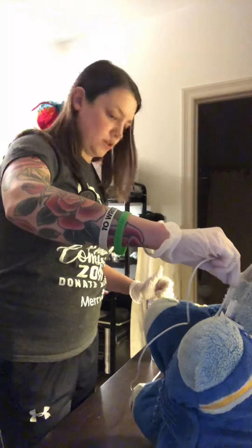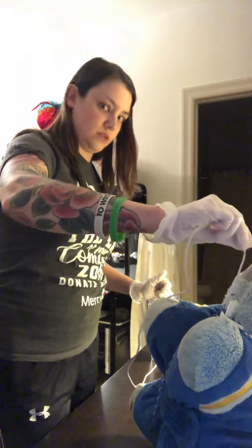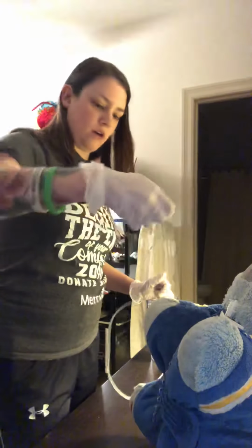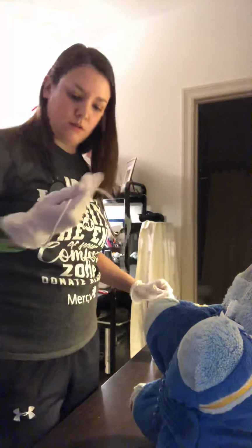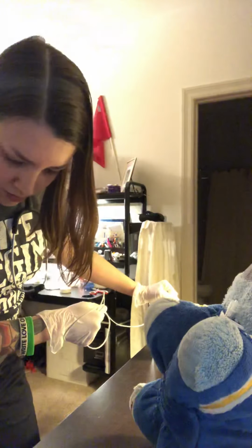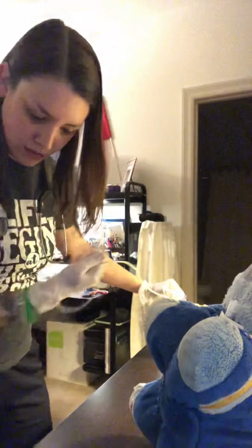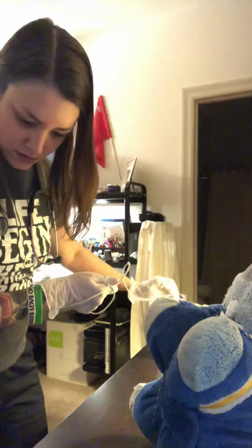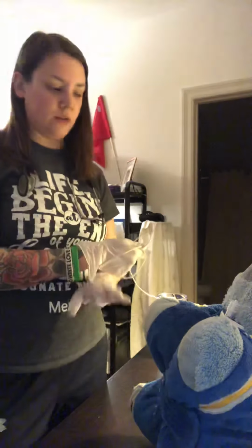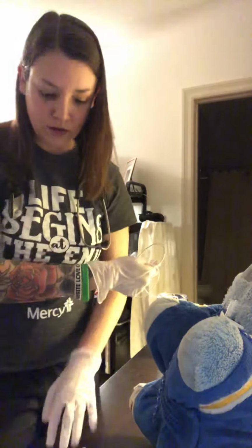Then I would apply suction and pull it out, kind of circle it around in there a little bit, and take it out. The patient might cough, so I'll go ahead and recoil this back around. And then I do sterile saline again, kind of get it all cleaned out, and wrap it around my dominant hand. I would make sure I do that for 2 passes, no longer than 10 or 15 seconds for each one.